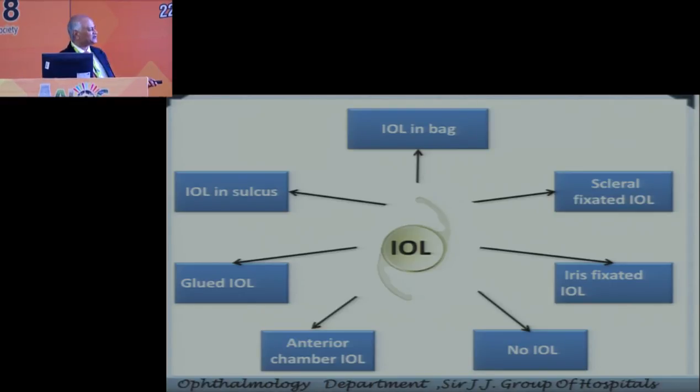So that is an iatrogenic blindness. So I am very much against that, and also against no IOL. If there are so many options available, then why should there be no IOL? So what I feel is these two options should not be used, and all other options can be utilized when there is such a situation.